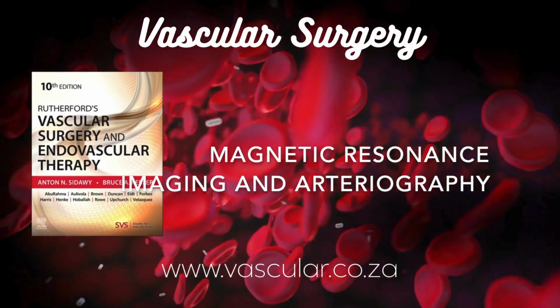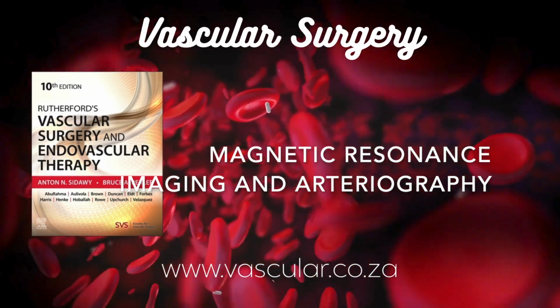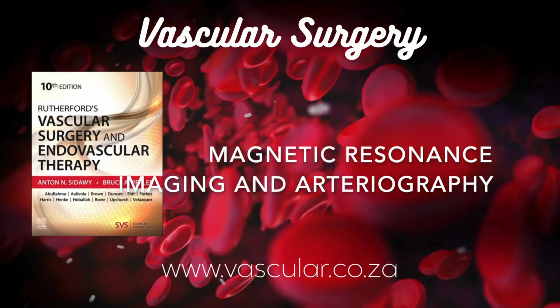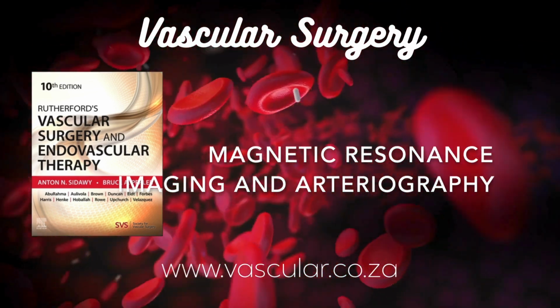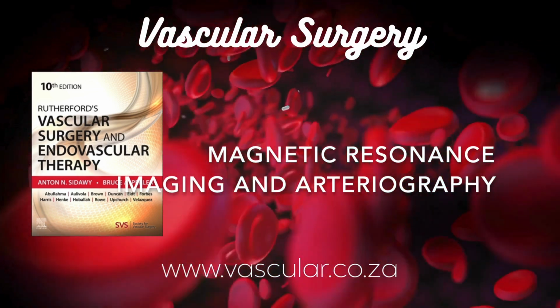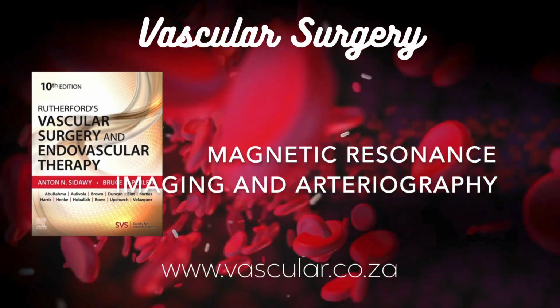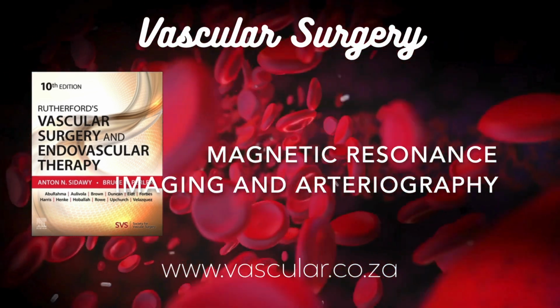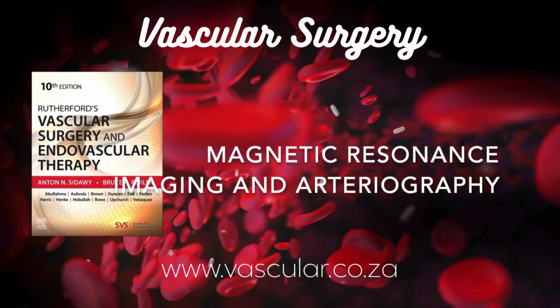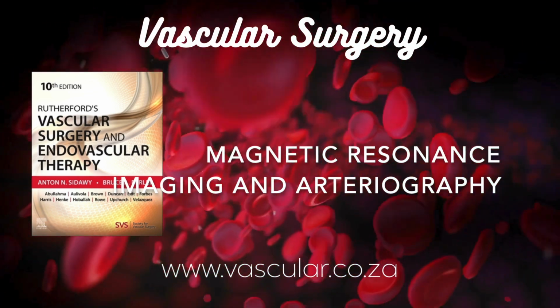Right. Parallel imaging is a collection of smart techniques that use the fact that we're receiving signals simultaneously from multiple coil elements. Okay. By analyzing the unique spatial information from each coil, the system can essentially reconstruct the image using less raw data, which means acquiring the data faster. Is there a catch? The main trade-off is usually a slight hit in the signal-to-noise ratio. So it works best when you have plenty of signal to start with, which is often the case in contrast-enhanced MRA. Most modern CE MRA scans now routinely use parallel imaging.